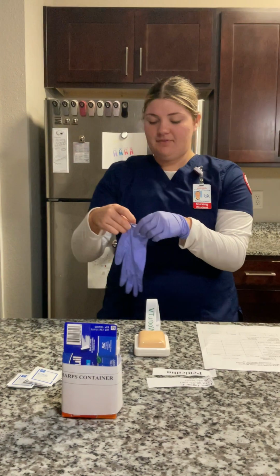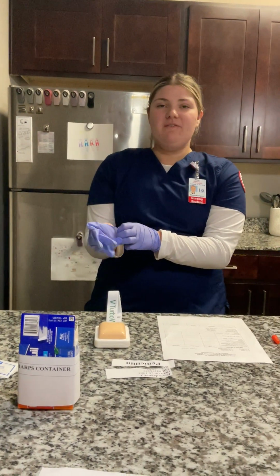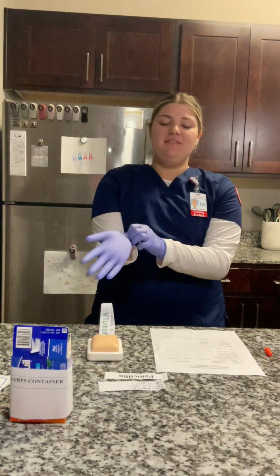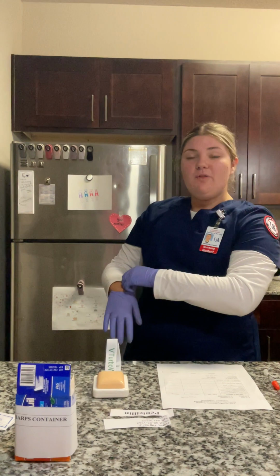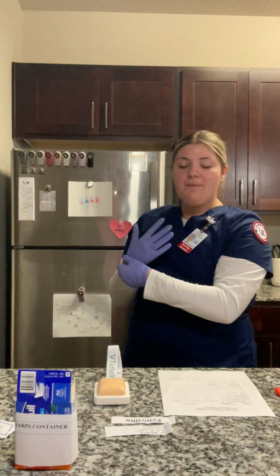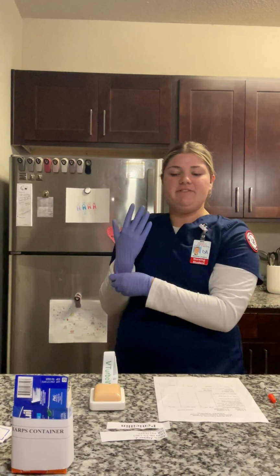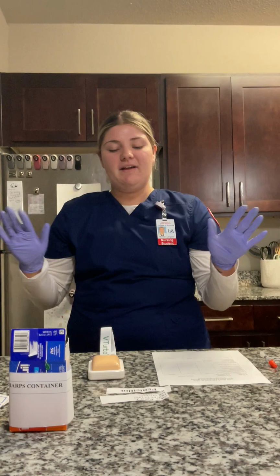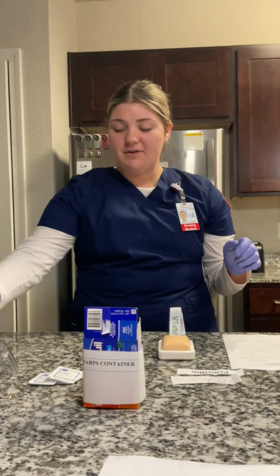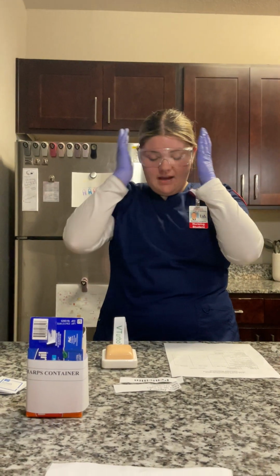Well, before I put on my gloves, I would have raised the bed to a comfortable working height, and I would have lowered the side rail, but I broke sterility there, so I would just note to do that before I would put on my gloves. And then I'm going to put on my goggles.